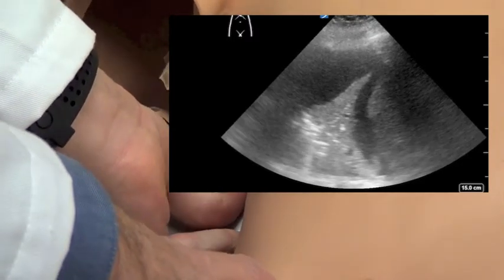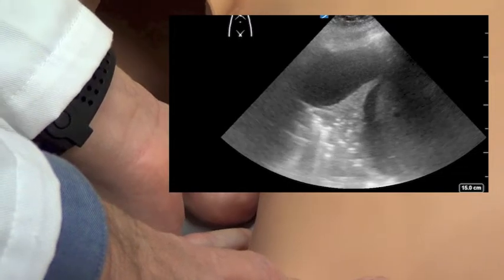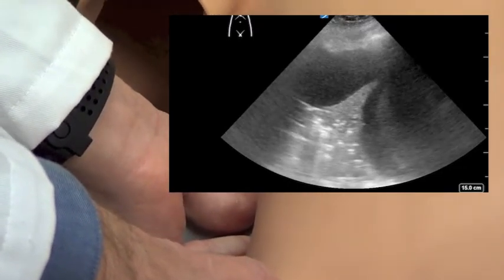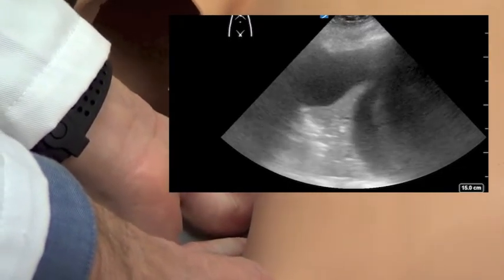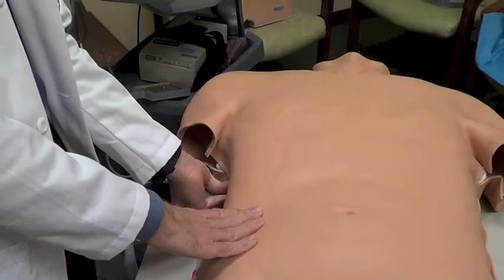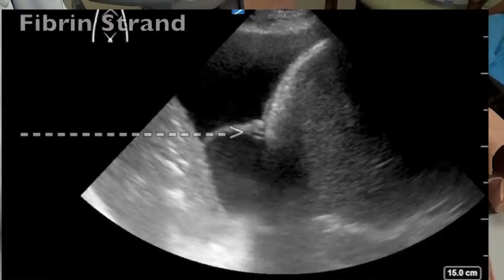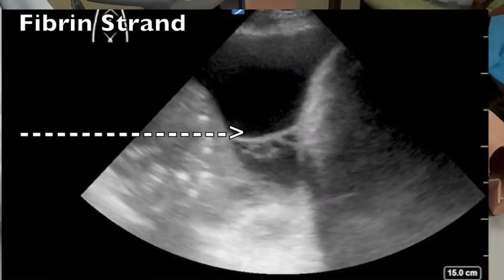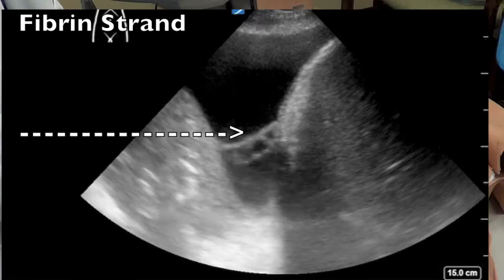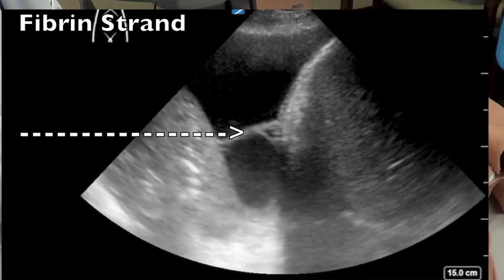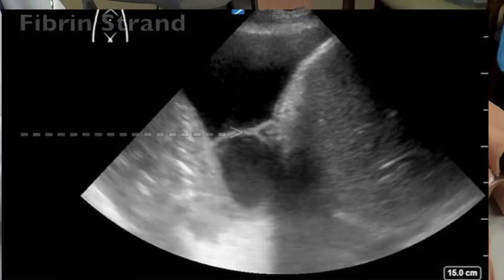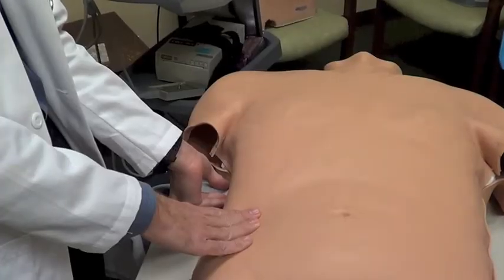In this case, I'm going to make sure that there's at least two to three centimeters of fluid visible. It appears as though there's a good pocket between the fourth and the fifth intercostal space laterally in the mid-axillary line.